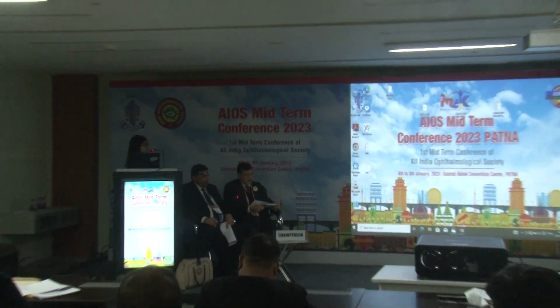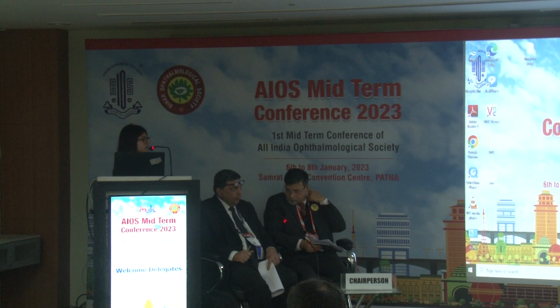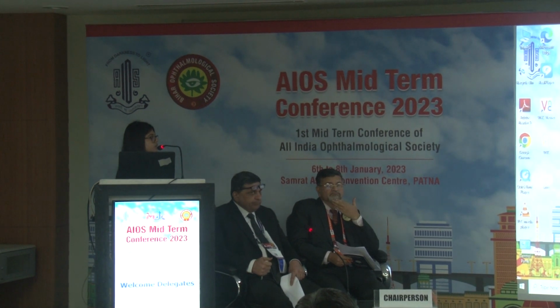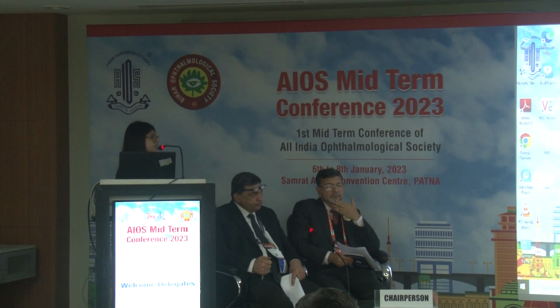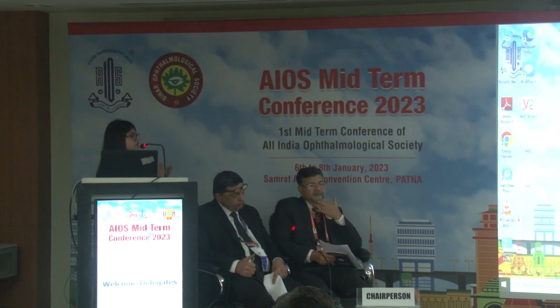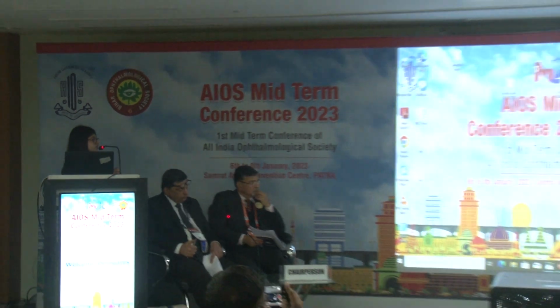Sir, in cases of... Which you invented? I haven't invented it, but we are using it in our practice. Like in the cornea department, the microbiological cultures that we send, the gram stain, the blood culture, chocolate agar, we incubate it overnight, and then we take the culture and use it for the sensitivity pattern. It gives the result in just 6 hours, and within the same day or two, we can give the result. That's technology which is available. Yes, sir.